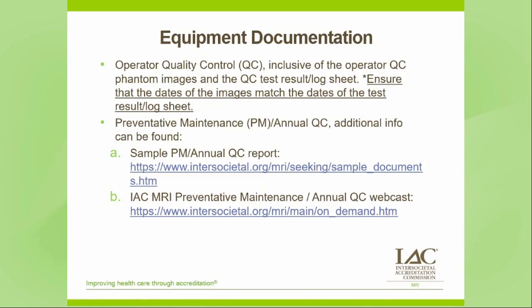and artifact. Now, many of the equipment vendors or the MRI unit manufacturers provide forms to record the results of these assessments. Some facilities even use an Excel spreadsheet. Either method is okay. The application will request the QC test results log sheet from 5 days of testing. Now, if you only do it 3 days a week, you'll have 3 days from 1 week and then 2 days from the next. Once the online application is submitted, you'll be asked to upload the case study images as well as the QC phantom images.